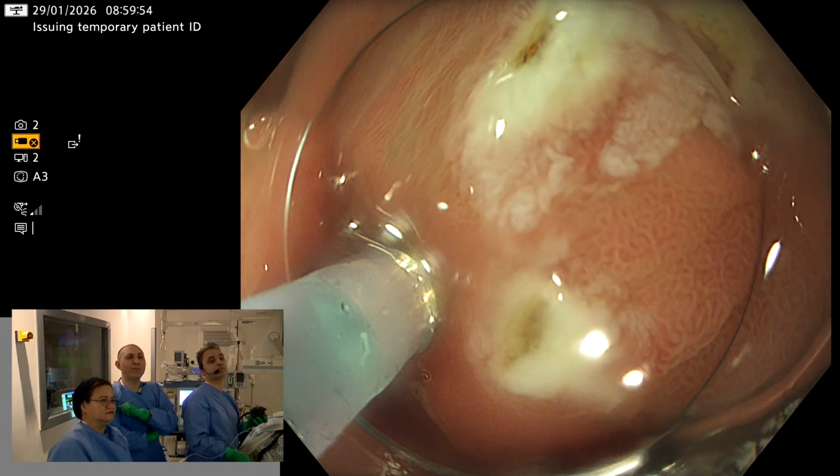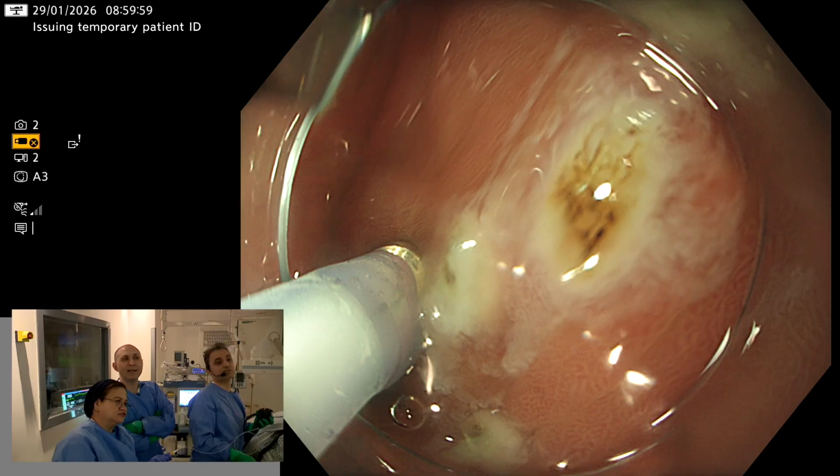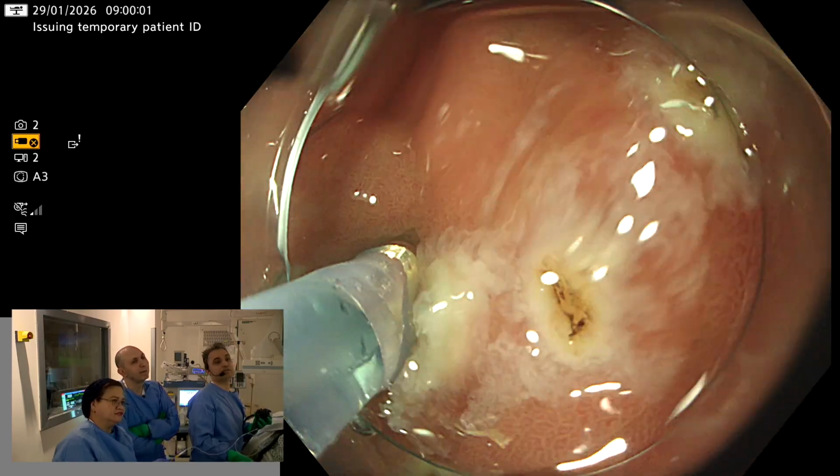Needle out. No biopsy was taken from the lesion. But there was... Needle in.